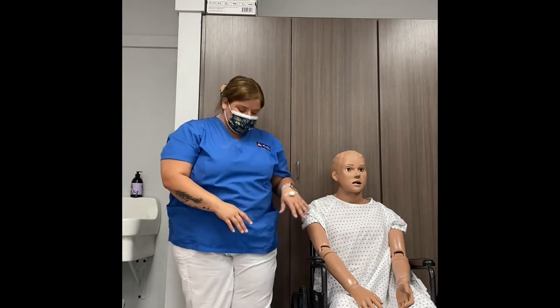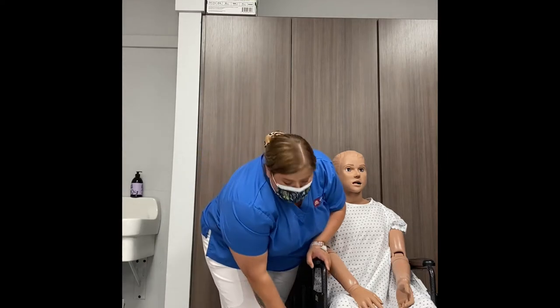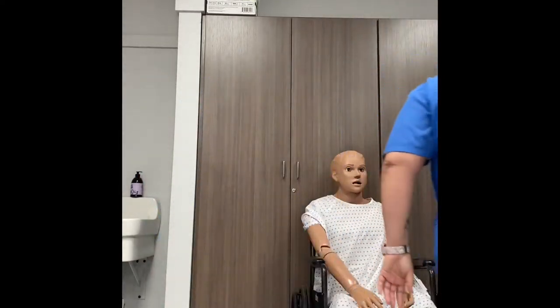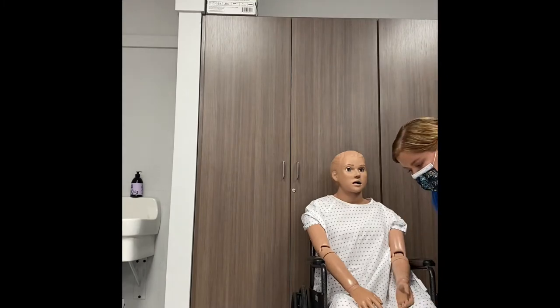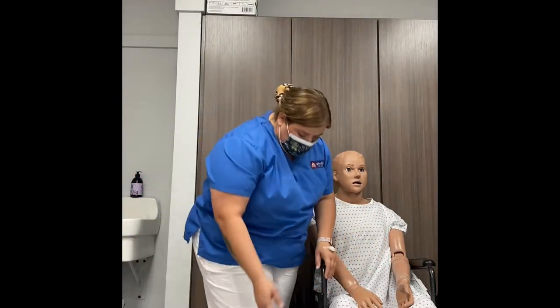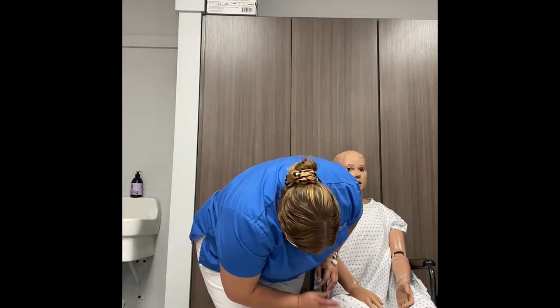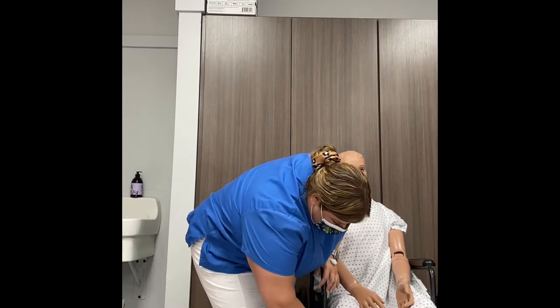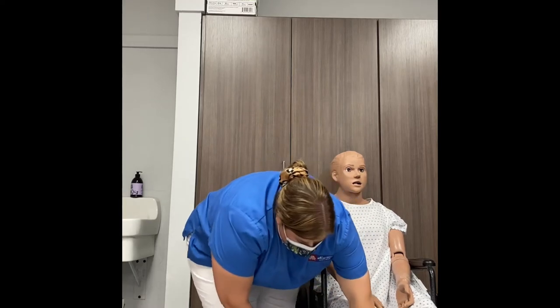First, lock the wheelchair by pushing down the levers on both sides, making sure there's no rolling of the chair. Next, move the foot guards out of the way by lifting them up and swinging them to the side.